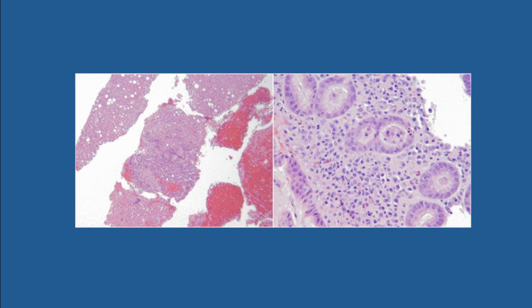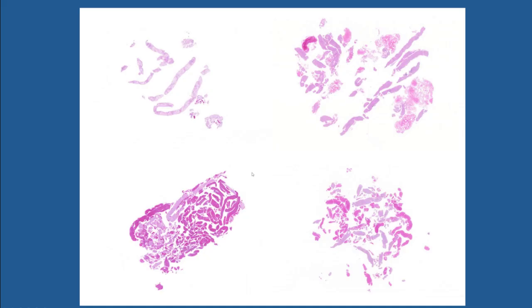And an underrated advantage of EUS is that you can diagnose Helicobacter pylori, because almost always, and that's a joke, because almost always when they do a liver biopsy through the stomach or the duodenum, you find a little piece of stomach or duodenum floating among those various fragments. In fact, when you see one of these, besides the fragmentation, you know that it is an endoscopic ultrasound-guided liver biopsy. And so this is what these biopsies look like.